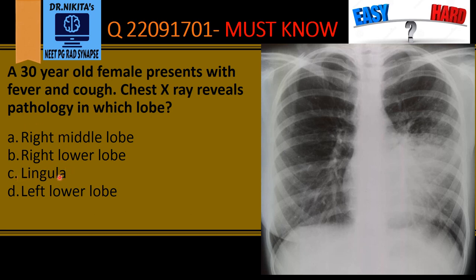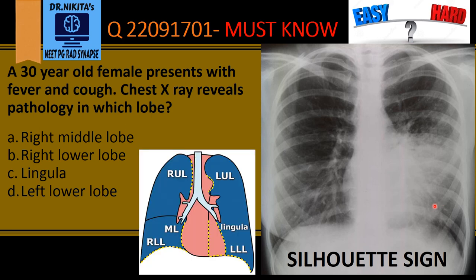We now have to select between options C and D, and this is done based on the sign called the silhouette sign. The silhouette sign says that if there is a pathology which obscures the left heart border, then the pathology is in the lingula.